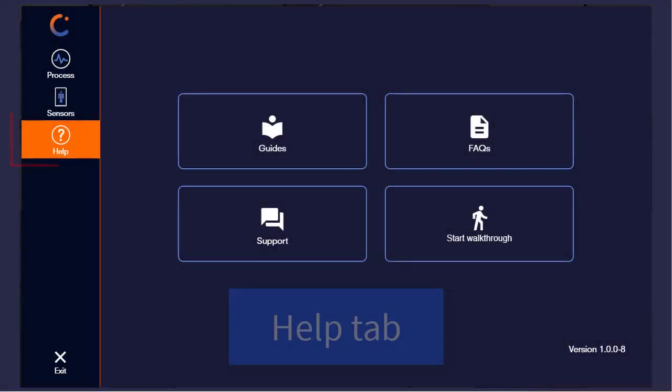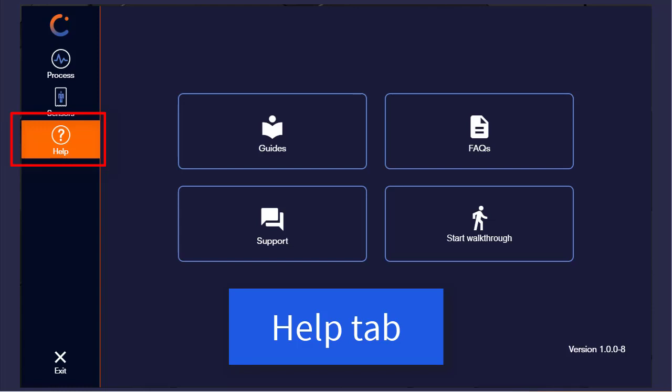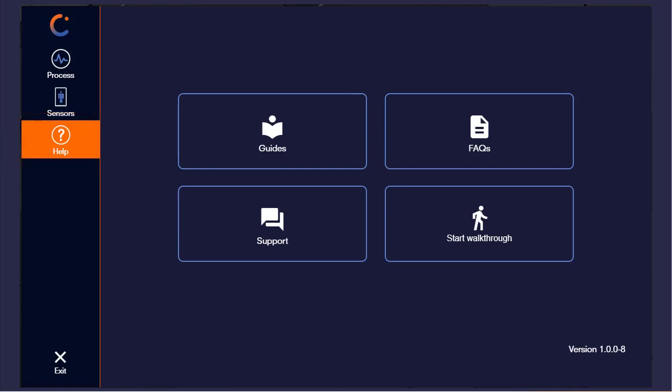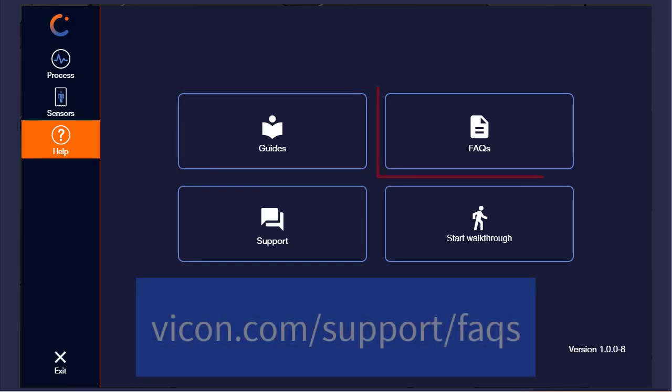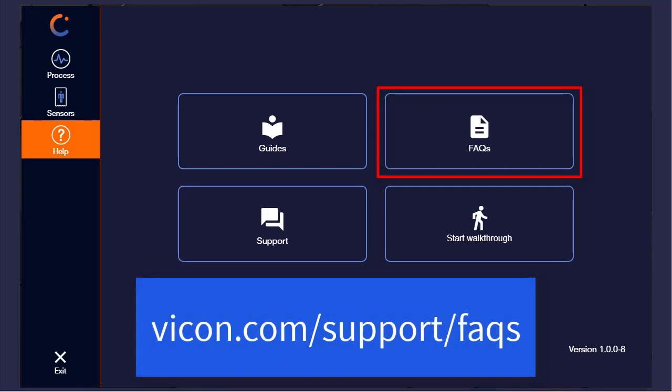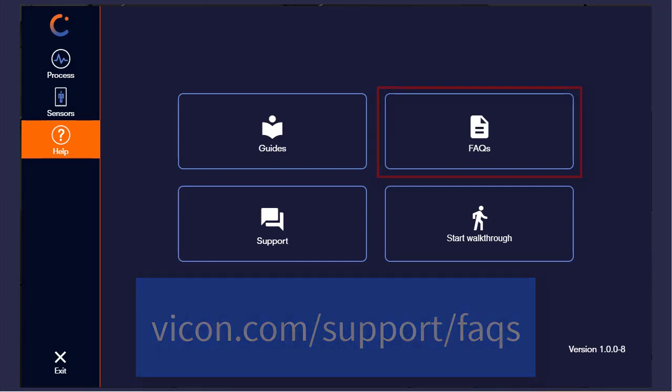The final tab within CaptureU Desktop is the Help tab. It contains four main options. Clicking on Guides takes you to the documentation page located at docs.vicon.com. Clicking on FAQs will take you to the FAQs section of our website.